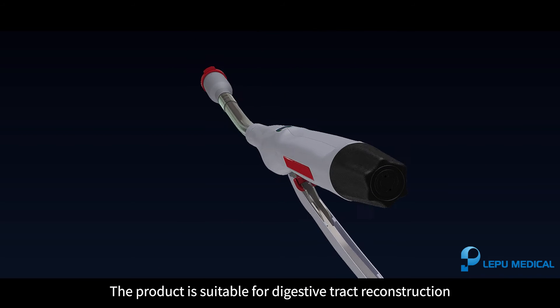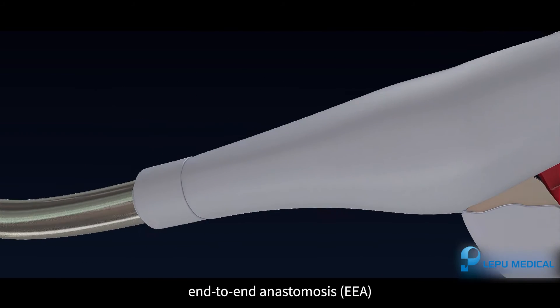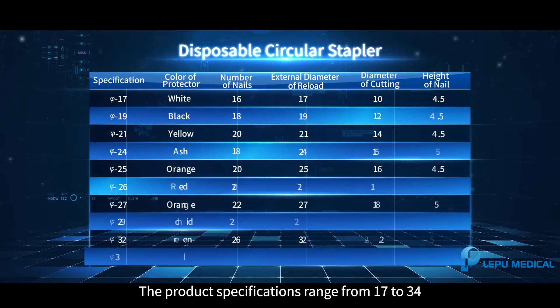The product is suitable for digestive tract reconstruction, end-to-end anastomosis, and side-to-side anastomosis. The product specifications range from 17 to 34.